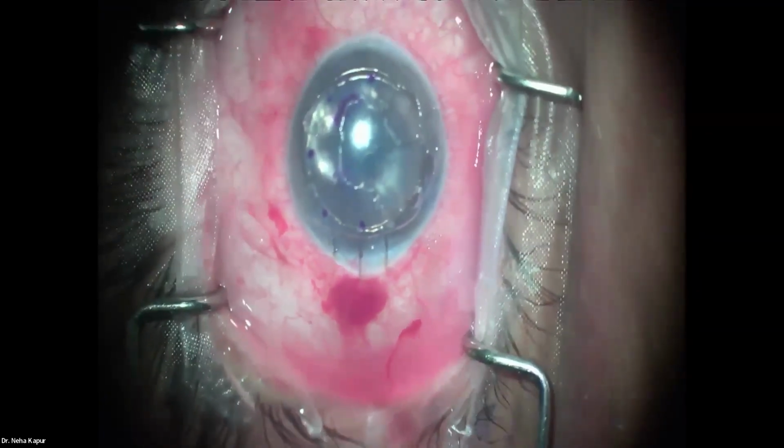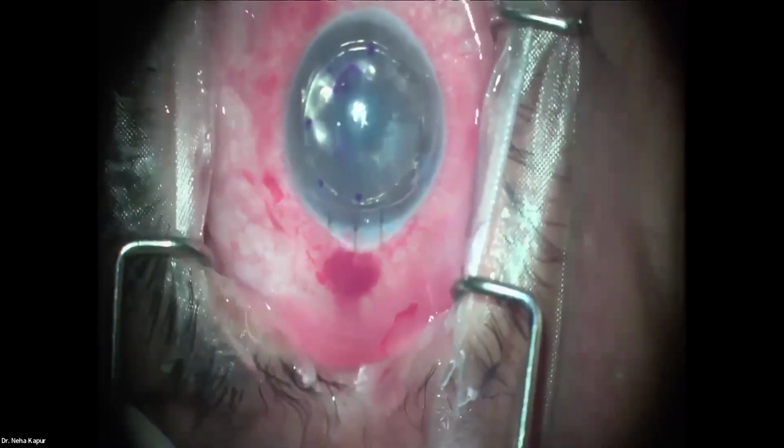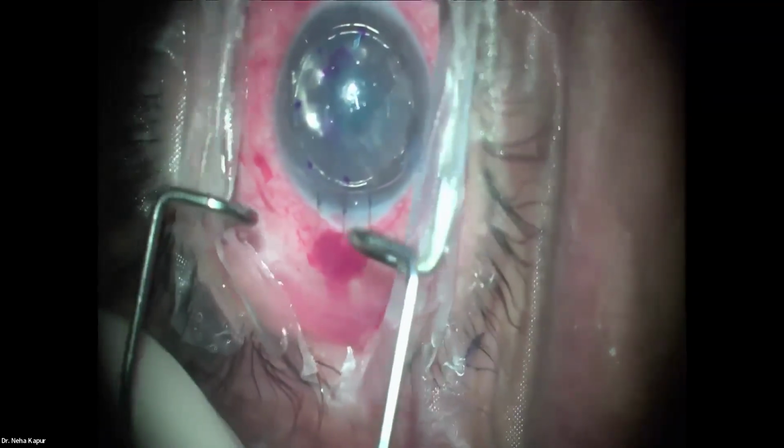Antibiotic. We like to patch the eye and keep the patient in post-op recovery for about 30 minutes. See the patient on the slit lamp once.